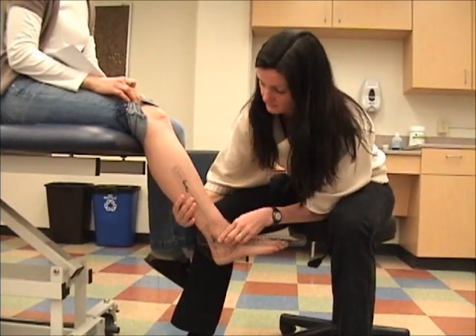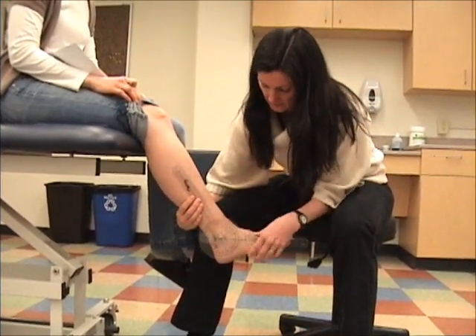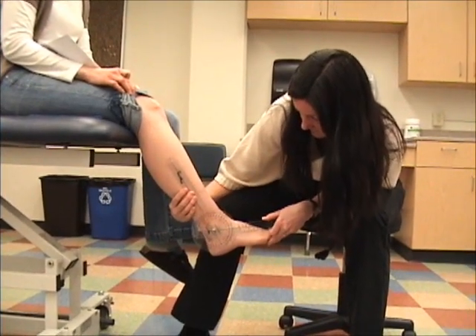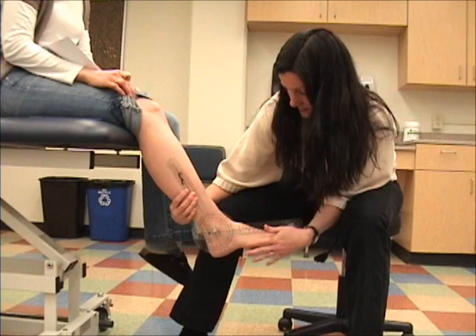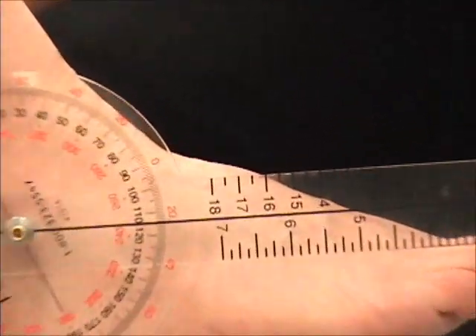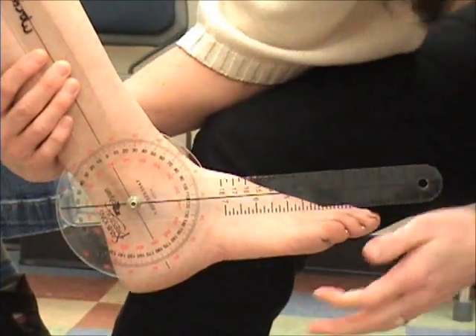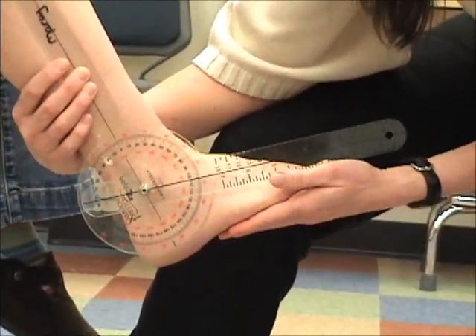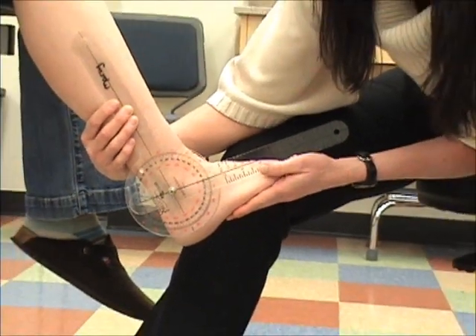I'm going to hold that there, and then this line is what needs to be parallel with that fifth metatarsal. From there, I'm already seeing that her foot is not in neutral, so I need to get her to a neutral position first.